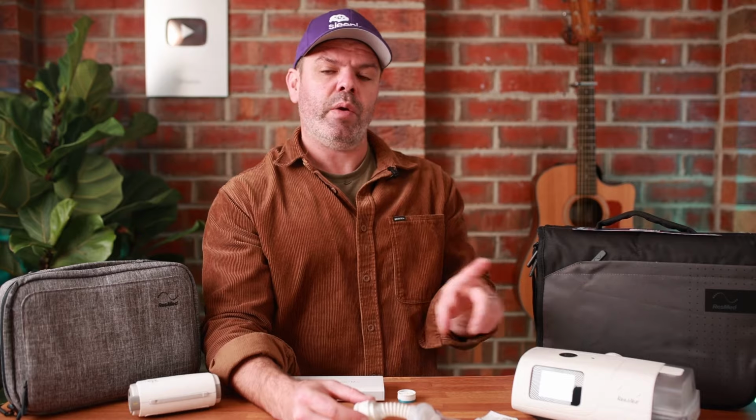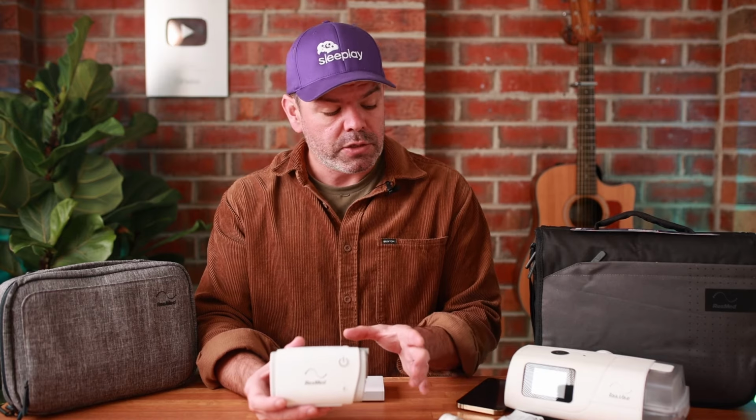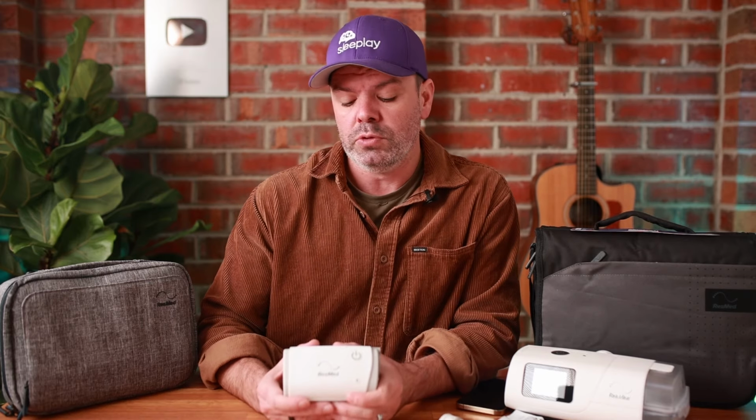They might not provide the same level of humidification as a full-size water-based humidifier. However, they certainly take the edge off the dryness and they're far more convenient for travel. So what about some of the cons, hey? Well, because of the small size, there's not much room for sound abatement foam, which is used to dampen the noise of the blower. So compared with the AirSense 11 that has sound abatement foam, slightly noisier. However, most patients who use this device find the noise is very acceptable.